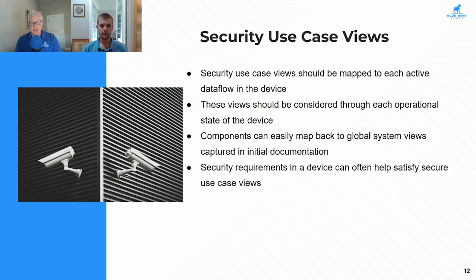I don't like this term, that zero trust thing people like to talk about, but essentially it sounds like that's what we're talking about here. We don't trust the output from any other system, so we have to verify it before we ingest it into our system before we do an analysis, because otherwise, we're making the mistake. Exactly. We technically shouldn't even trust the input from our own systems.